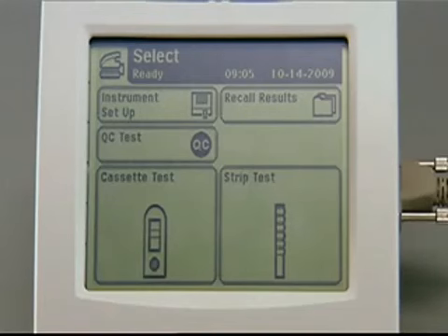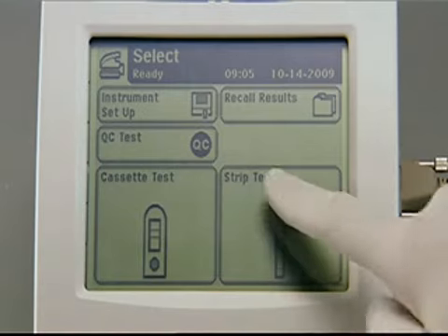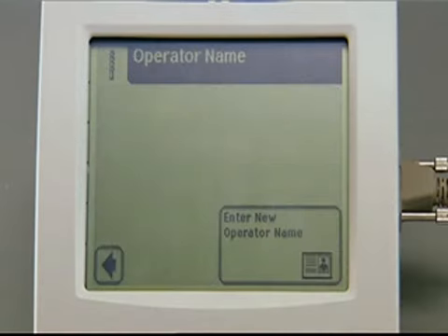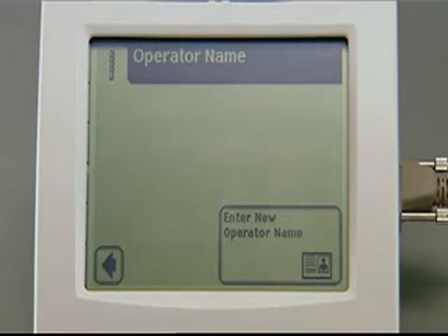From the main select screen, touch Strip Test to access the Operator Information screen. If the same operator is accessing the analyzer, you may see a Last Operator button. If a different operator is using the analyzer, the Enter New Operator option is used. For this demonstration, we'll use the New Operator option.